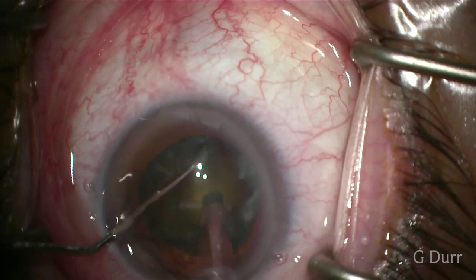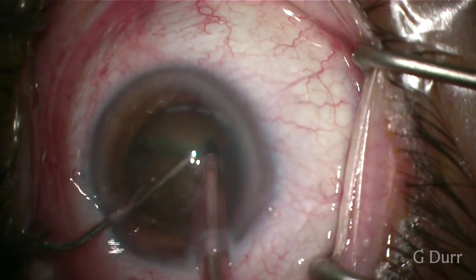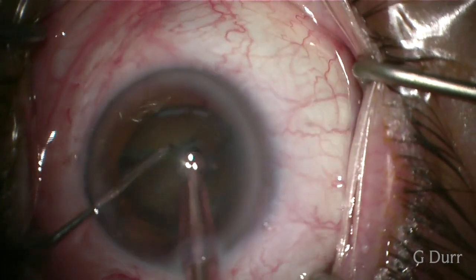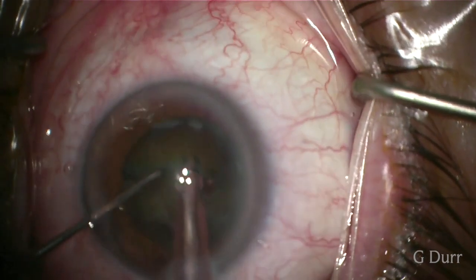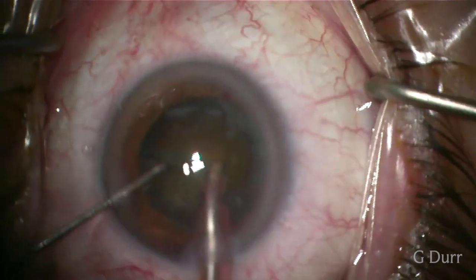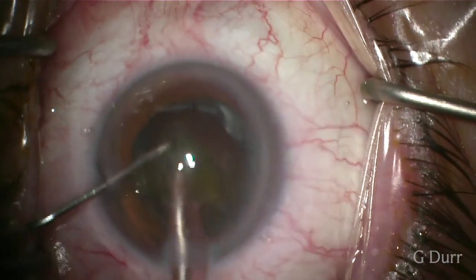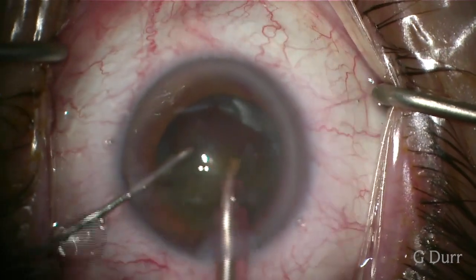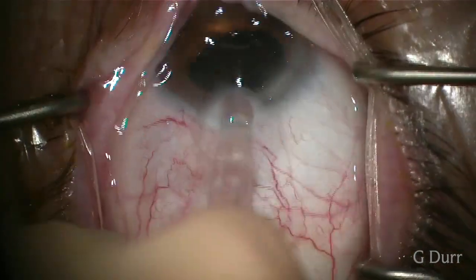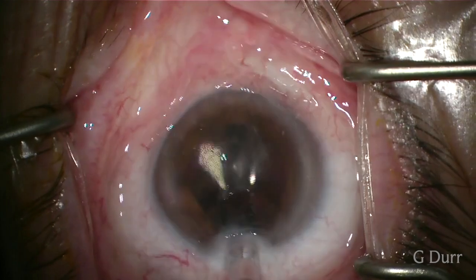We then go ahead and do our cataract surgery using a quick chop technique, which went quite uneventfully, with a hemiflip of the nucleus. We place our intraocular lens into the capsular bag and then start looking at if there's any flow from the nasal angle.